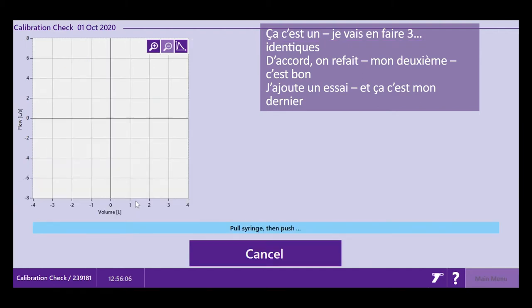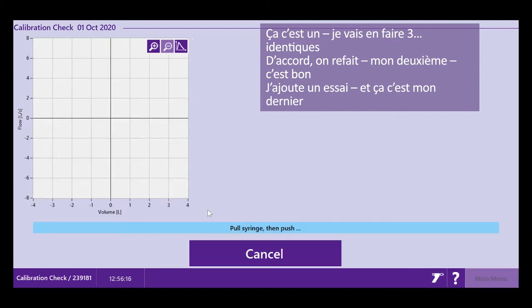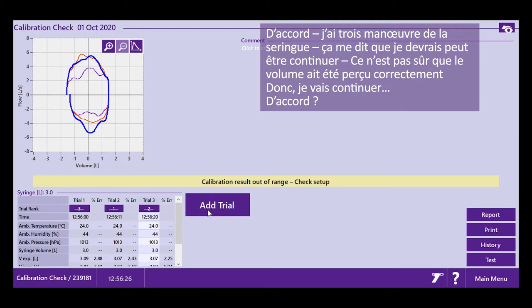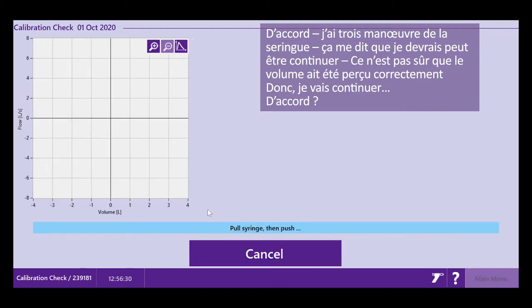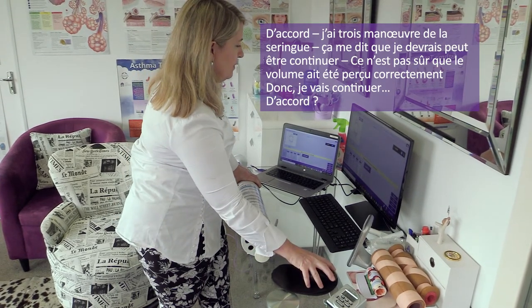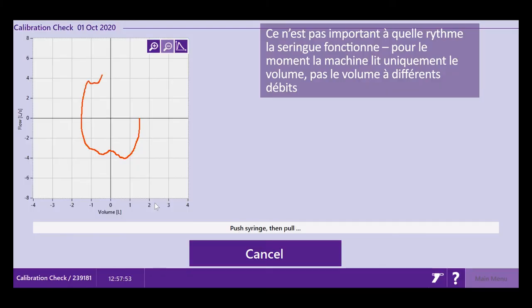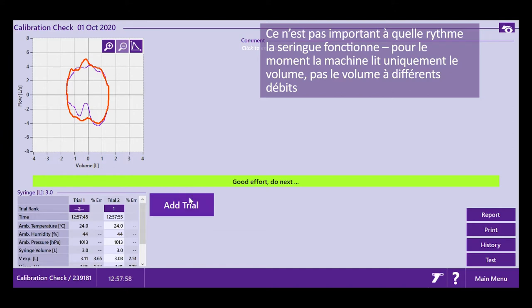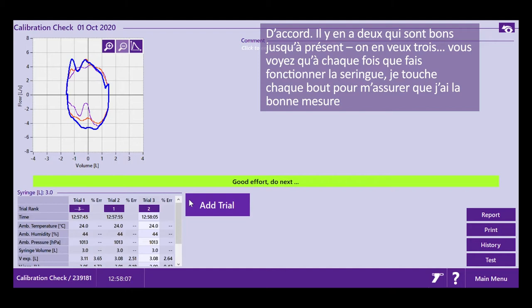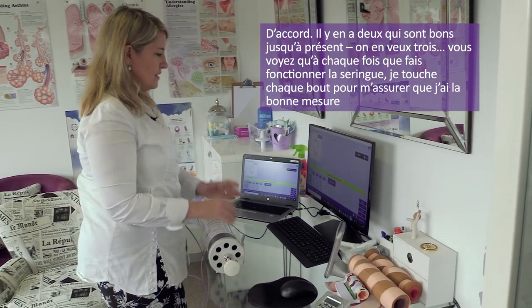I just do three pumps exactly like this. The machine is only reading the volume — it's not reading volume at different flow rates. Notice how I'm moving my syringe to touch every time so that I have a correct measurement. The software may keep prompting you to continue if it's not satisfied the volume is reading correctly, so just keep going until it's happy.